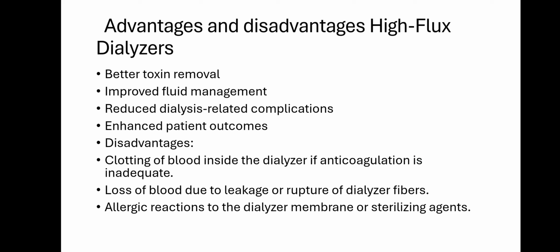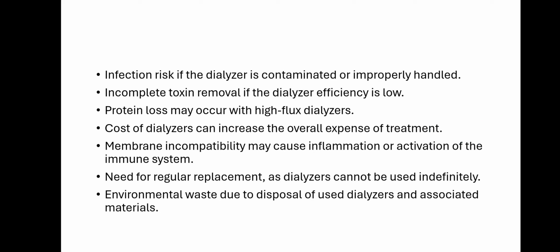The disadvantages of dialyzers: clotting of blood inside the dialyzer if anticoagulation is inadequate. Next, loss of blood due to leakage or rupture of the dialyzer's fibers, and allergic reactions to the dialyzer membrane or sterilizing agent. There is an infection risk if the dialyzer is contaminated or improperly handled. There can be incomplete toxin removal if the dialyzer efficiency is very low.